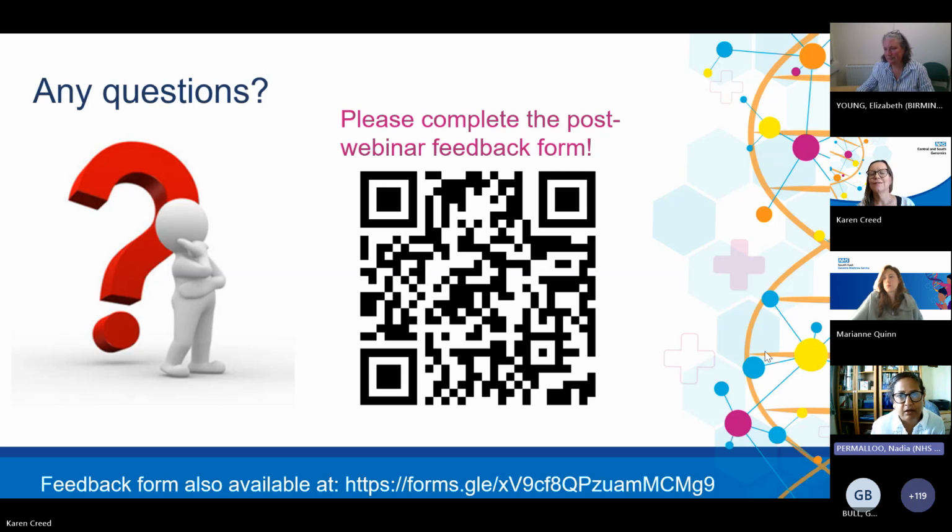Now, this may be one of the things that we definitely change, but it's a good point to talk about because we know that the markers for combined are indiscriminate. So most of the T13s we will actually pick up via a higher chance T21 result.